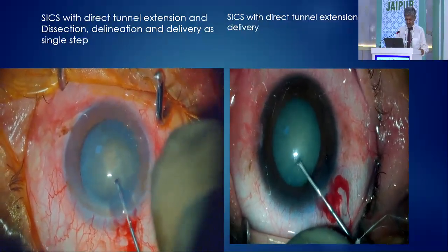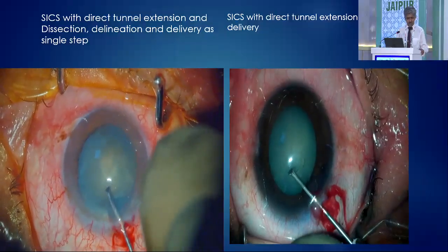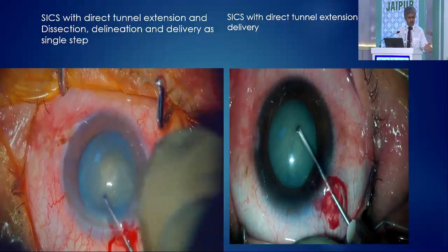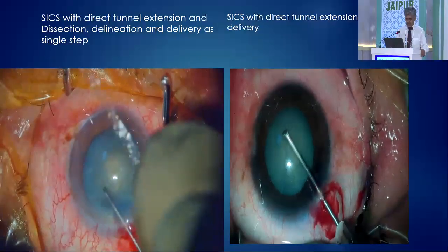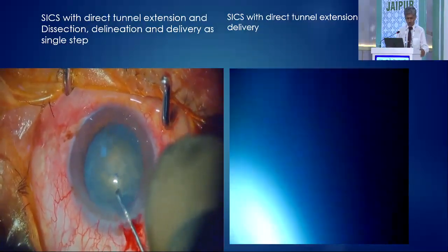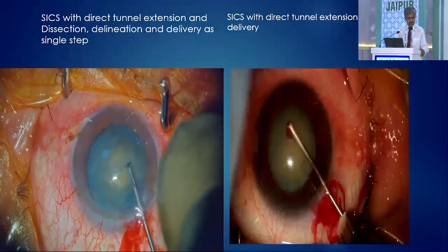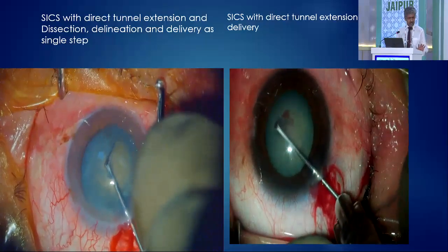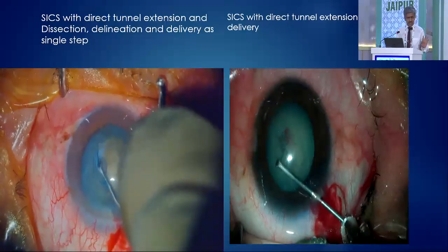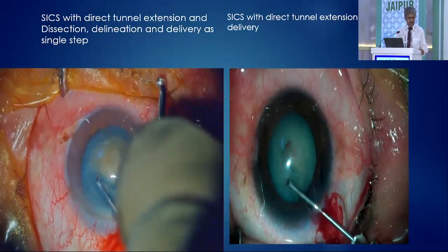For some of my senior residents who are doing it, I ask them to go straight for it, bypassing all the steps. There could be two or three limitations or questions that different colleagues have always put to me about this technique, but most of the time it works well. You can see I can still perform phaco emulsification if I wish.